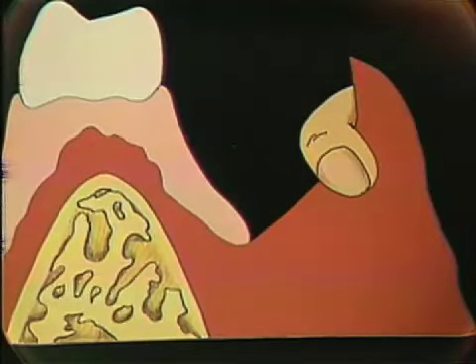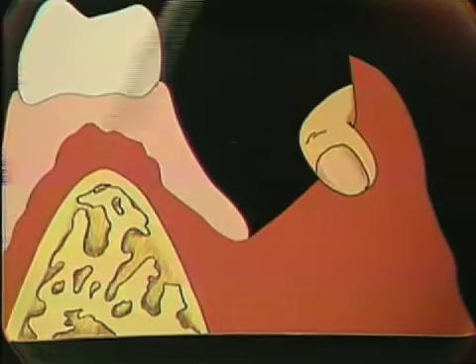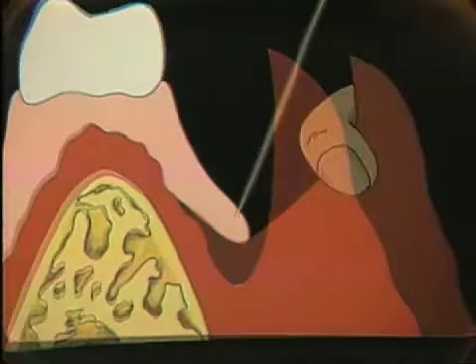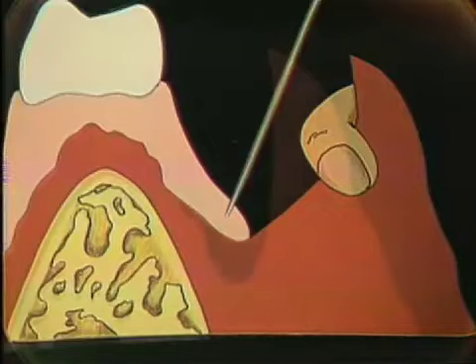Now, if we see the effect of this, if we let go of the tissues, when this base is placed back in the mouth and the tissues are at rest, you can see what happens to this base. It no longer fits the tissue. The base is not an accurate copy of the ridge. The only time that this base would fit accurately is if we distorted the tissues again. But when the tissue is at rest, this base would not fit the tissues.